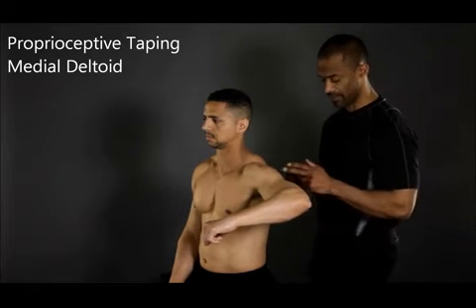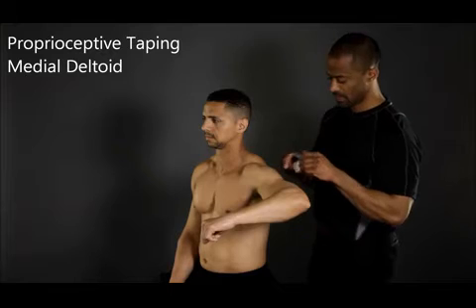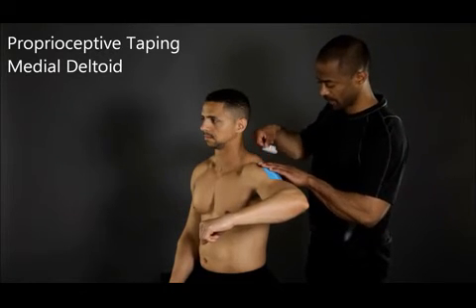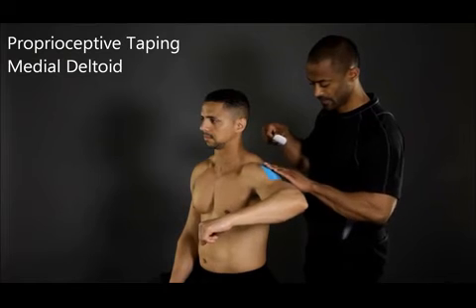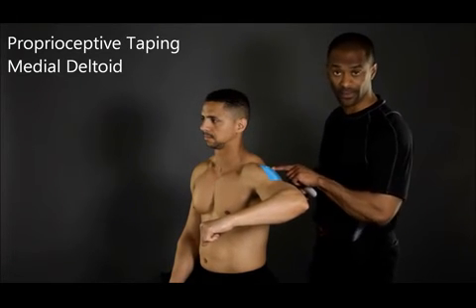Start by anchoring the tape at the distal end or insertion. Tape along the fibers of the muscle towards the proximal end or origin. During application, ensure that the tape isn't stretched.